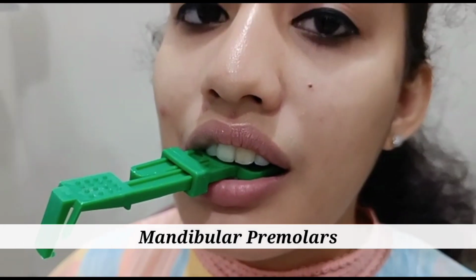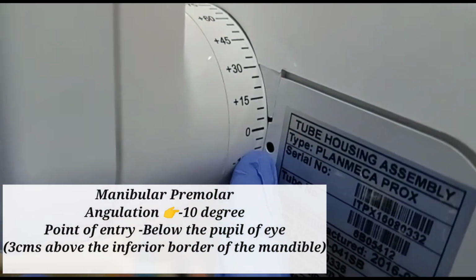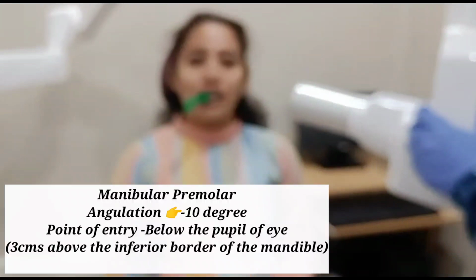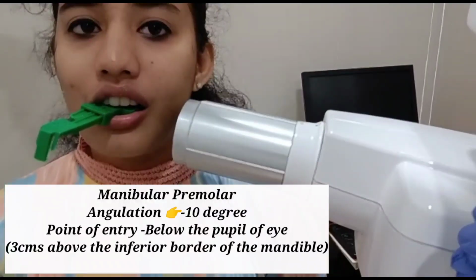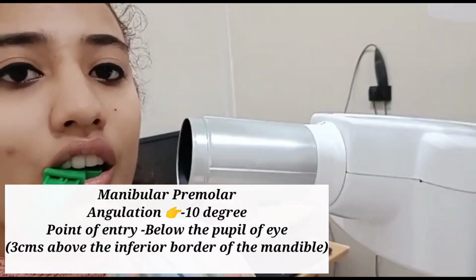Now we are positioning the vertical angulation for the mandibular premolars, which is -10 degrees, and the central ray is directed in such a way that the point of entry is below the pupil of the eye, and that is 3 centimeters above the inferior border of the mandible.